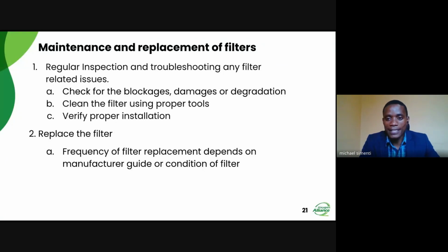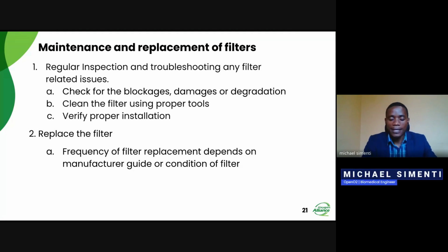Moving forward, let's look at maintenance and replacement of filters. Now we just want to dwell a little more on how we should maintain these filters. I would like to share well-detailed information on things that we need to do at our health facilities, wherever we are. The first point that we need to take into consideration is that we need to regularly inspect these filters and troubleshoot any filter-related issues.